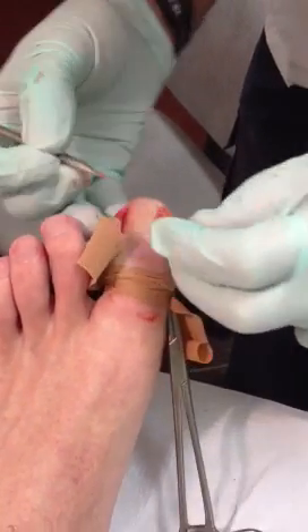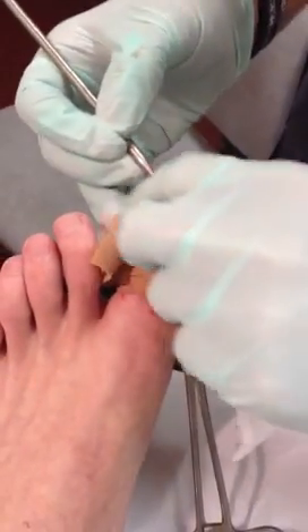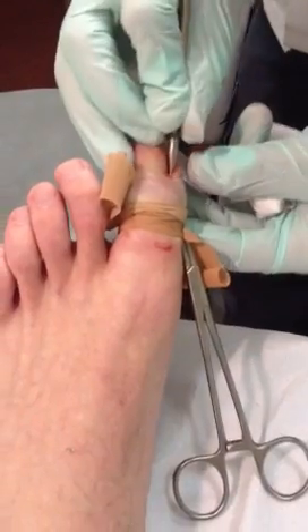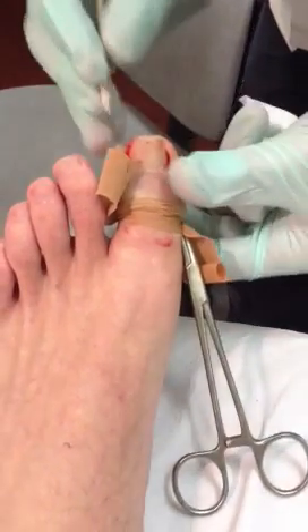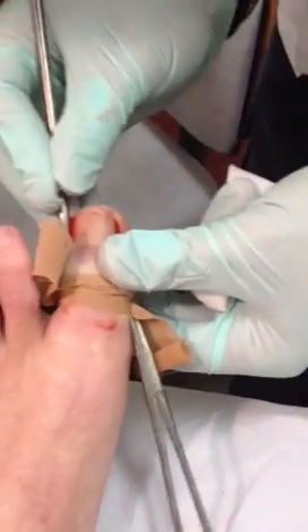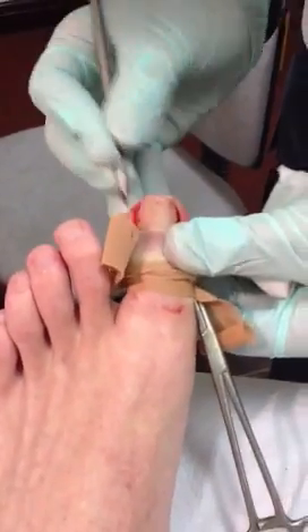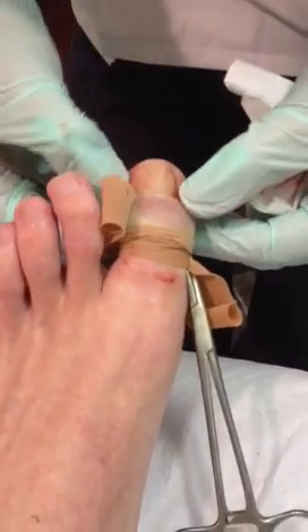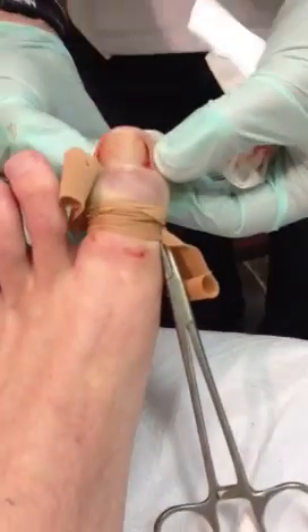That was a bit more there. This is skin — this is dead skin. So there we go. We've got those gaps both sides now.